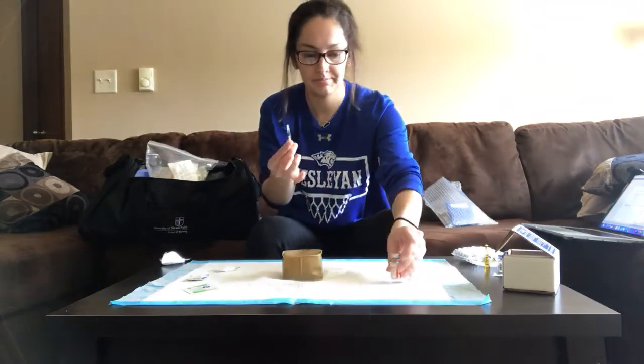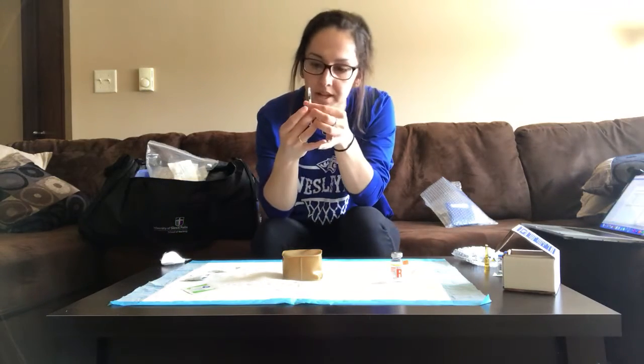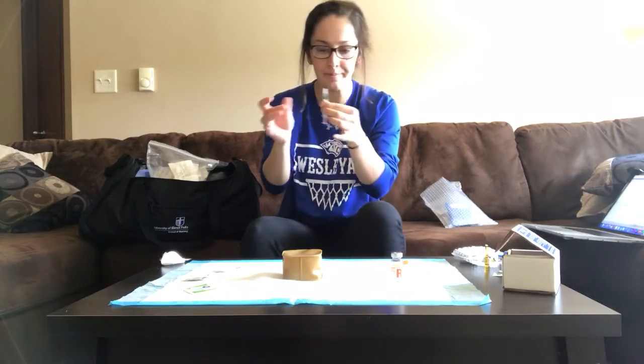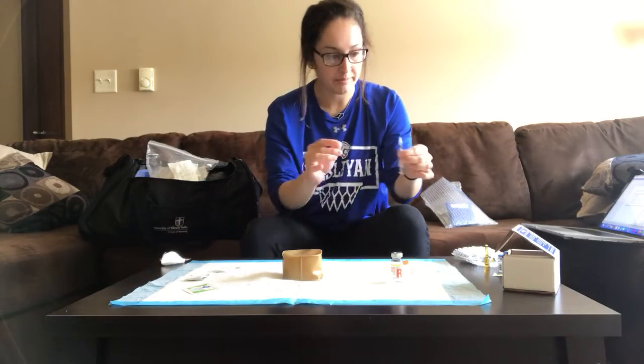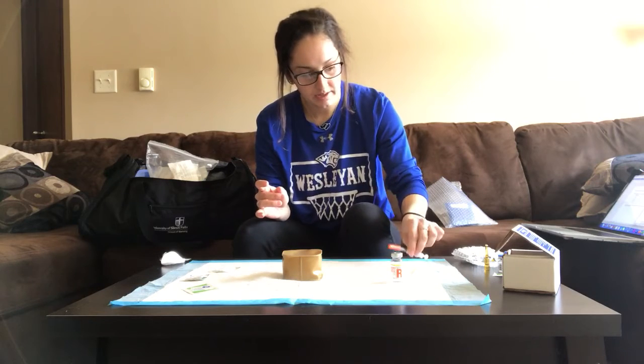Flip it over. Take the needle out. Inspect if there's any air bubbles. Again, give it a little tap if there are, to put them on top. Okay, so we got 9 units in there. So then I'm going to cap it again with the one-handed scoop.